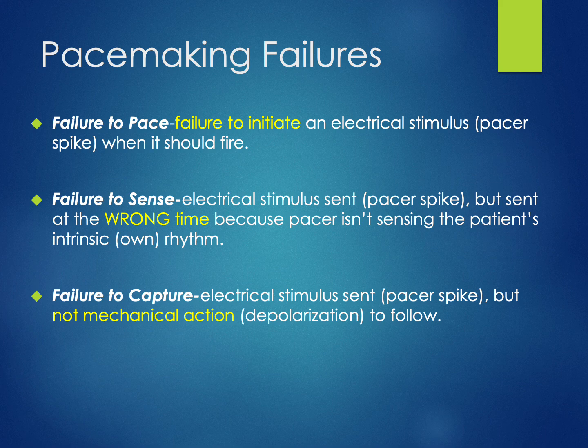So first, let's look at when the pacemaker just isn't sending electricity. That's failure to pace. And it's exactly what it sounds like. The pacemaker isn't pacing. So think about it as the pacemaker just being turned off. That's not actually what's happening, but it makes it easier to understand. So now this may happen all the time or for a longer period of time, or it could just happen for a few seconds.